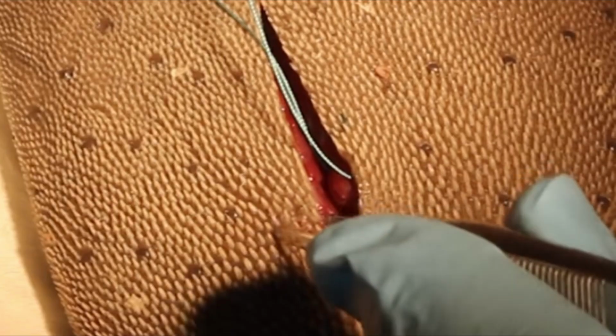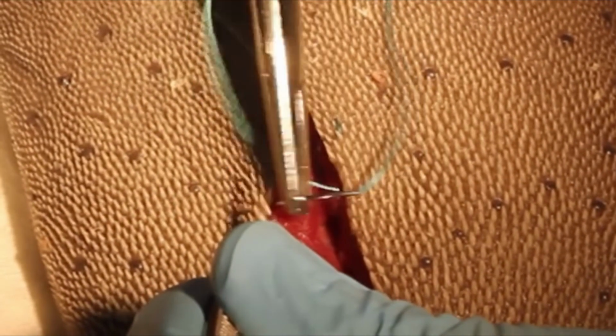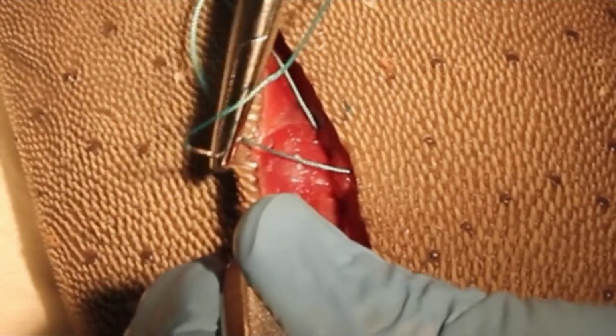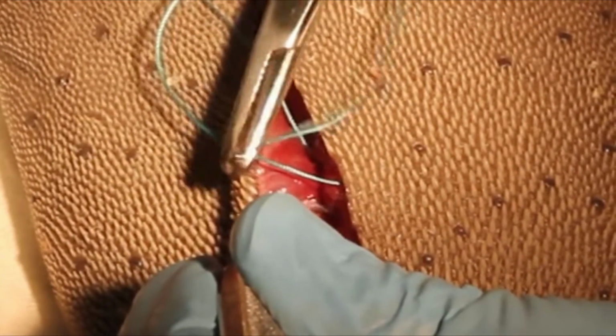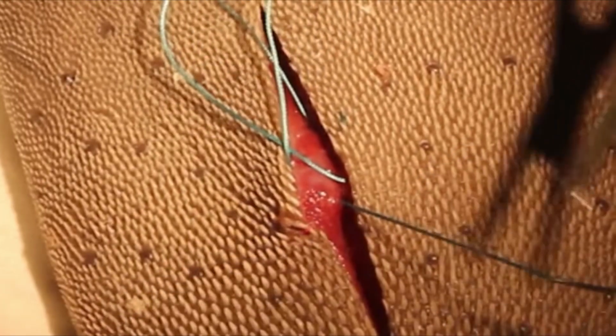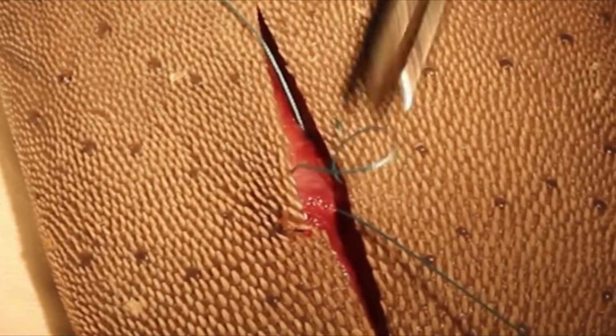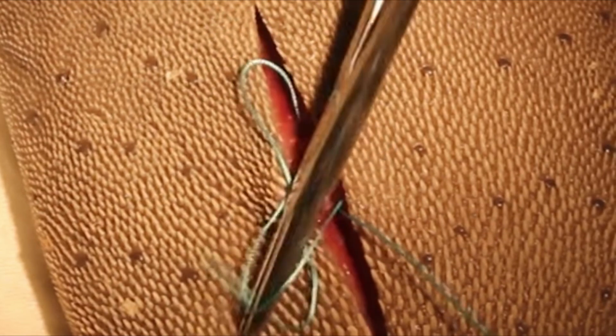Now move to the opposite edge and mirror the depth in the opposite direction. Enter at the subcuticular plane and drive the needle down to exit at the base of the wound. This superficial to deep pass is the second half of the inversion. Here is the critical checkpoint. Before tying, both strands need to be oriented on the same side of the stitch.